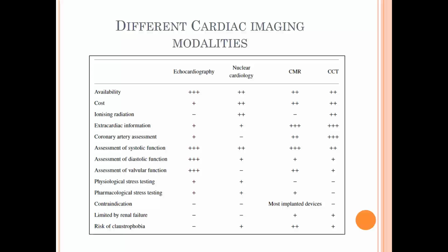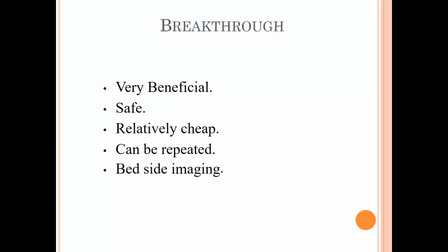But when we want to examine extracardiac anatomy or the coronary artery assessment, this is better done by the CT and the MRI over the echocardiography. The echocardiography is very beneficial, being safe, relatively cheap, can be repeated, and it can be done bedside.